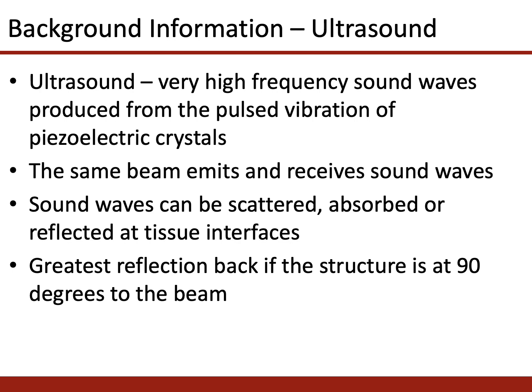So what is ultrasound? Ultrasound are very high frequency sound waves that are produced from the pulse vibration of piezoelectric crystals. So these are a type of crystal located within the ultrasound probe that vibrates as electricity is applied across it. The same ultrasound beam emits and receives sound waves. So as the electricity is applied across these crystals, a beam is created, it's emitted through the ultrasound probe, there is a pause, and the reflected sound waves are received back.